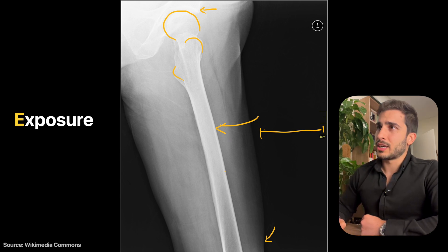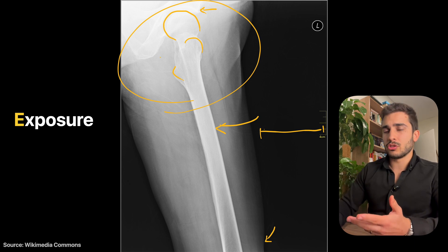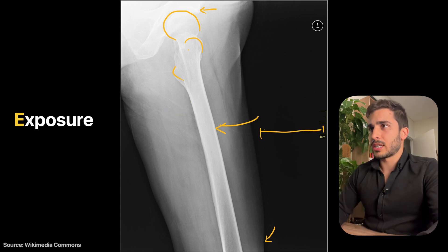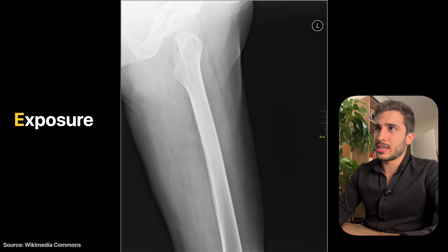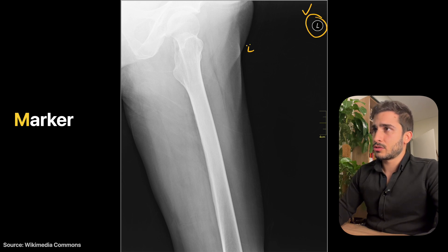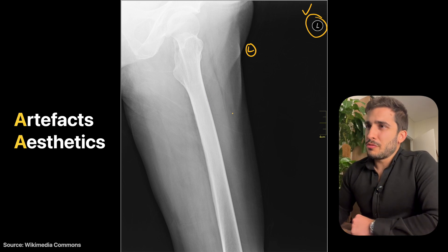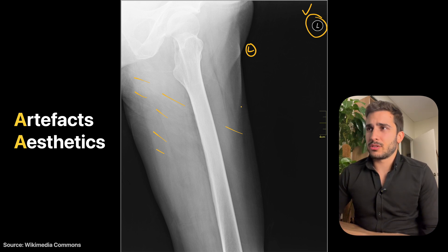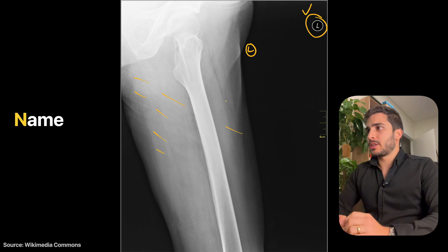Exposure looks a bit underexposed, particularly in the upper areas which are denser compared to lower areas. The same exposure settings work for some parts but not others. Since pathology is common in that area, you want good coverage — increasing both KVP and MAS would have been ideal. Post-processing could help, but noise levels may be hard to fix if exposure was low enough. The left marker is correct but should be closer to the anatomy. Clothing artifacts are visible as small streaky lines.